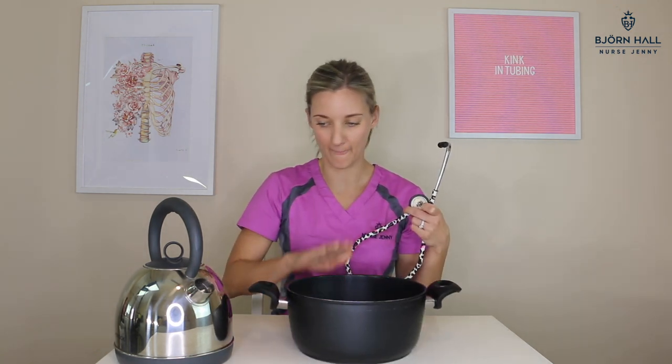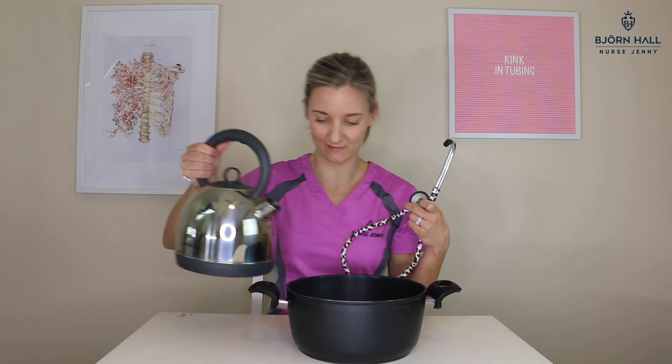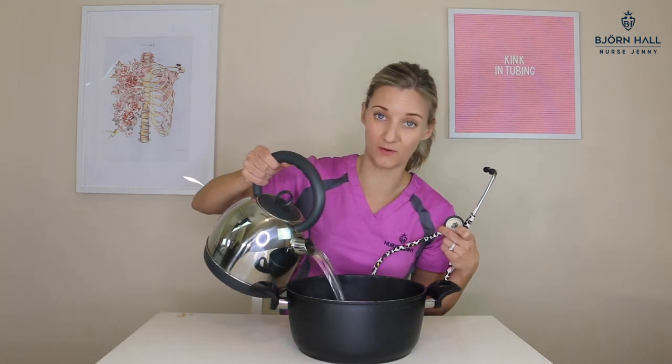Number one: boil a full kettle of water and then pour it into a saucepan or something similar that can hold very hot water.